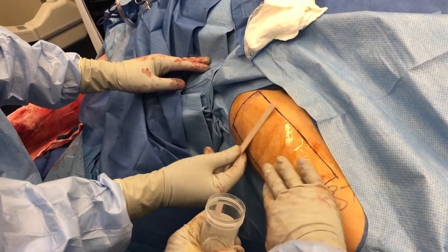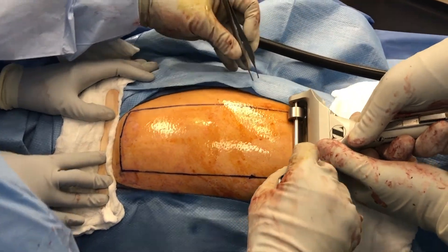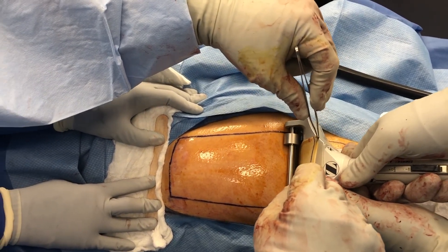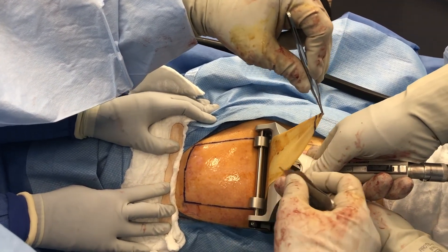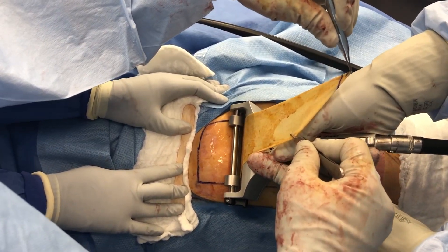After mineral oil is applied to the donor site, the dermatome is turned on and comes down at approximately 45 degrees to where it hits the skin. Constant downward pressure is applied so this doesn't skip on the skin and create holes in the skin graft. The skin is being held tightly on the far side in order to provide as smooth of a surface as possible.